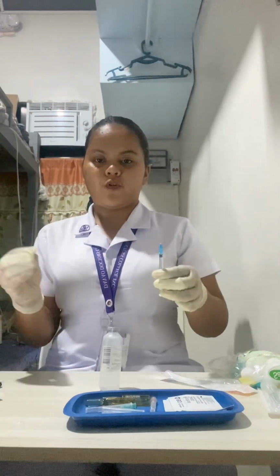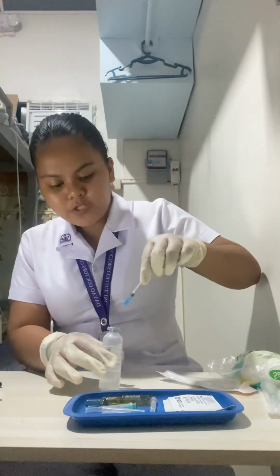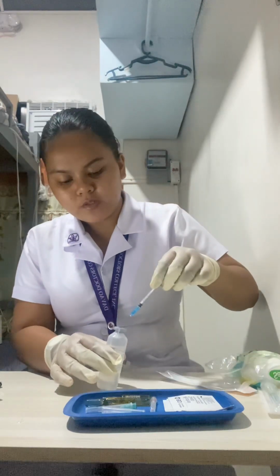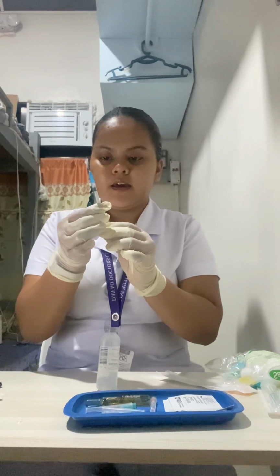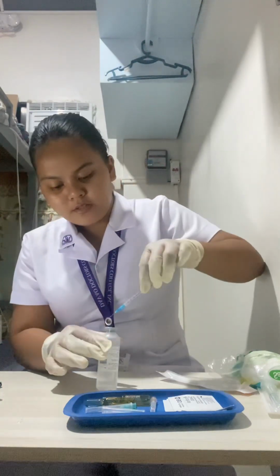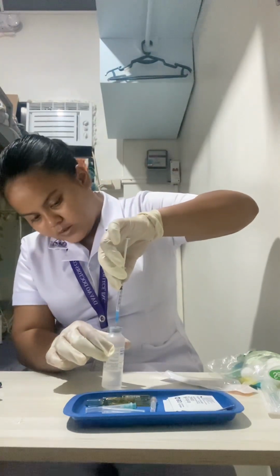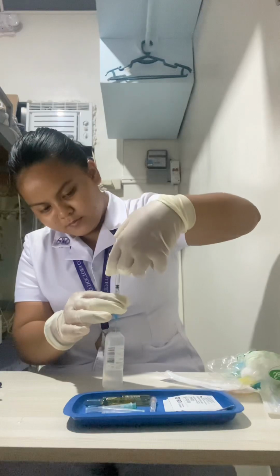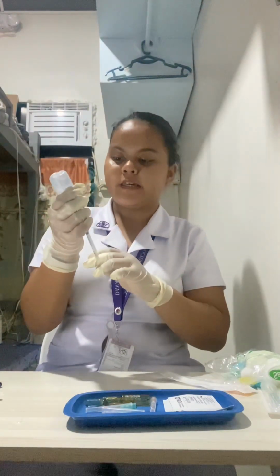So now I'm going to perform the second method of withdrawing medication from a vial. The second method is inverting the vial. First, before inverting the vial, I'm going to inject air equal to the medication volume into the vial. And then I'm going to invert the vial.